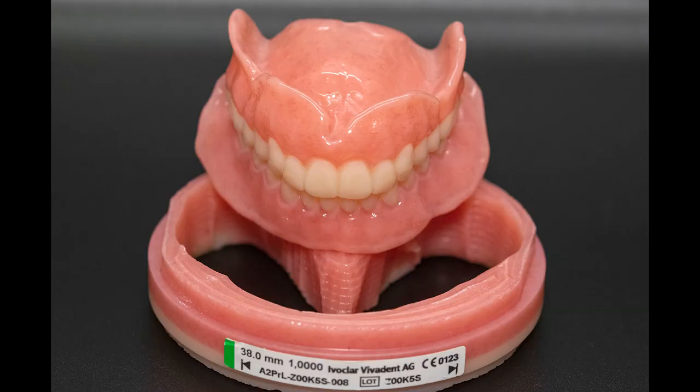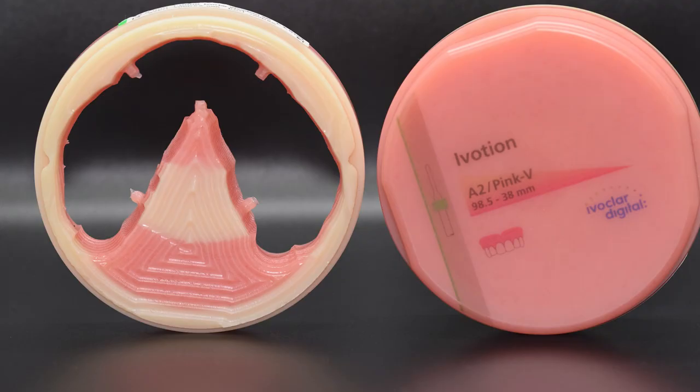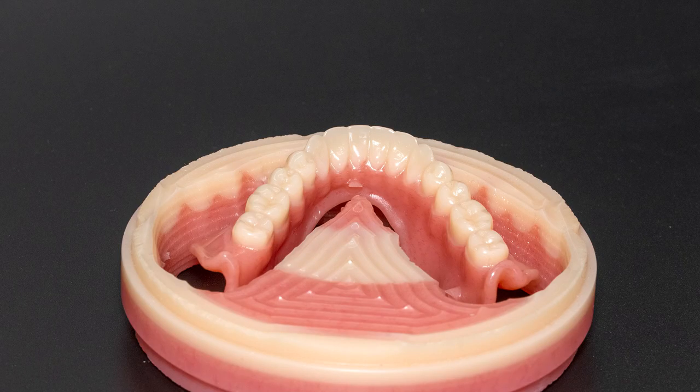The third full denture option we offer is the Ivocean Monolithic Denture. New from Ivoclar, this denture is milled from a solid piece of PMMA material. The main advantage is that the teeth and denture base are not made separately and combined, but is one monolithic unit. This should help the denture maintain its strength at what would typically be a weak point.